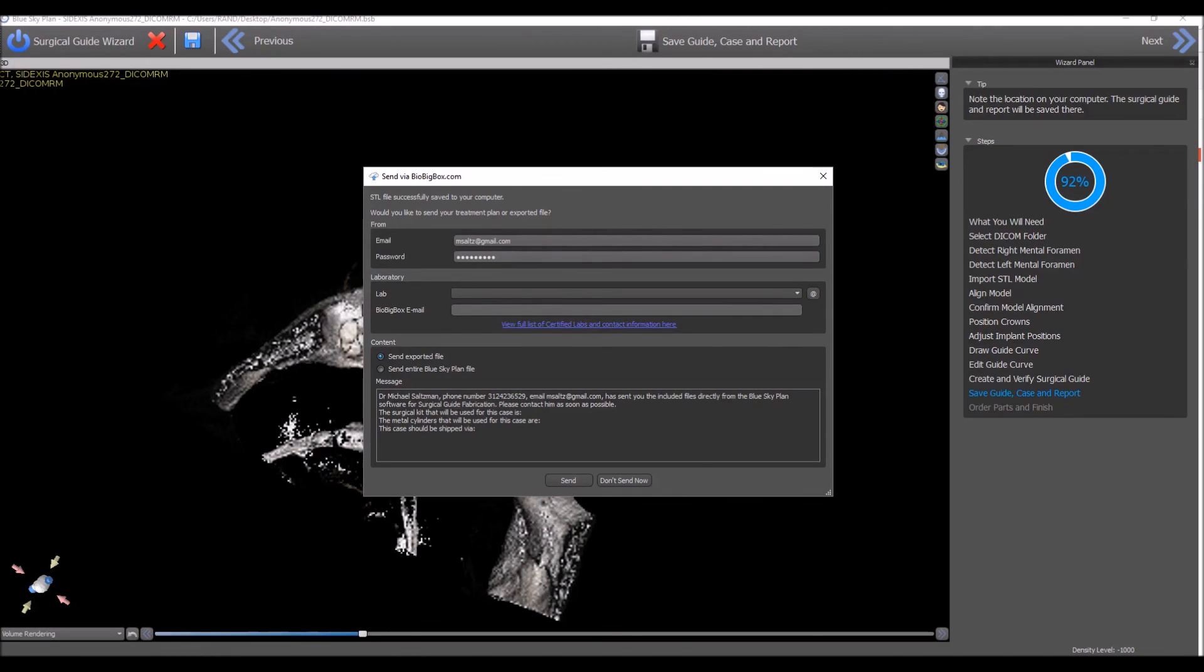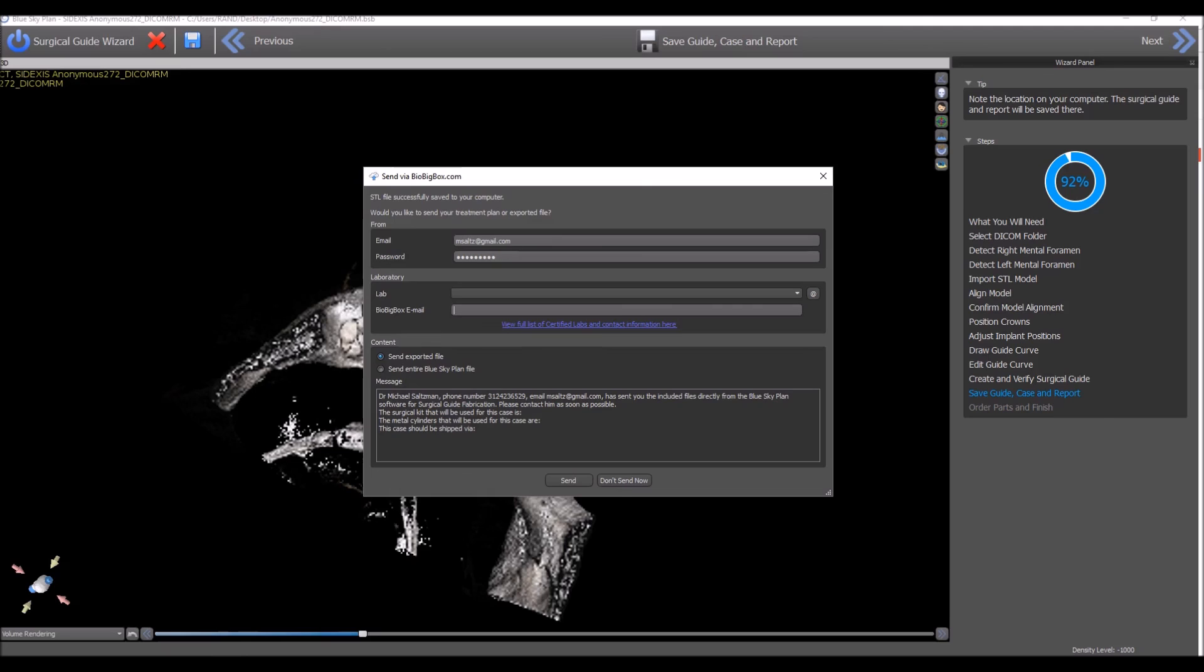Once the file is transferred, you will receive an email saying that the file has been transferred successfully so you know for sure that the file has been sent. In addition, the recipient will receive an email allowing them to download the file or to view it online via the BioBigBox system.